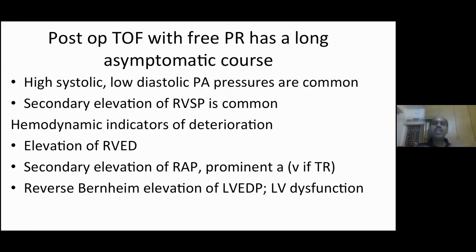If there is a very severe pulmonary regurgitation in the setting of very severe pulmonary hypertension, the right ventricle does not tolerate it at all, and usually these patients are not alive to the point of seeing a severe pulmonary regurgitation. Most of the patients who are having a hypertensive severe pulmonary regurgitation, if you put in catheters into the pulmonary artery and right ventricle, you will find a large diastolic gradient.